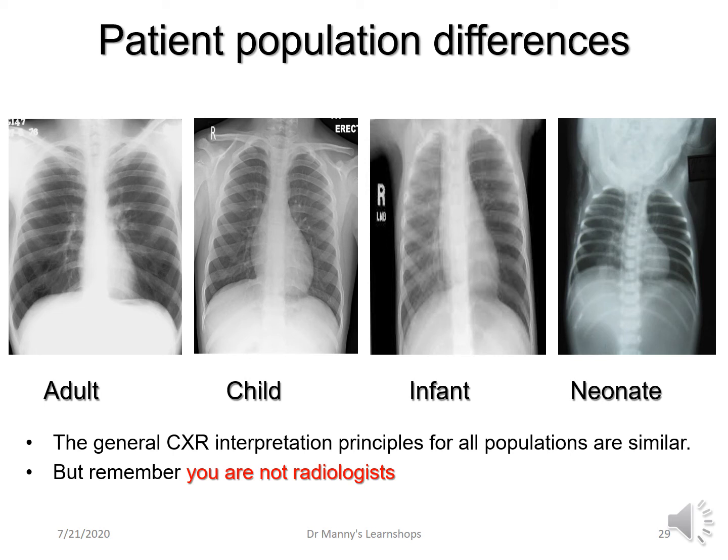So when you're looking at chest X-rays, remember who you are. Whether you're a physician, whether you're a nurse, whether you're a radiologist, it's the radiologists who are the experts, and they make the final interpretation.